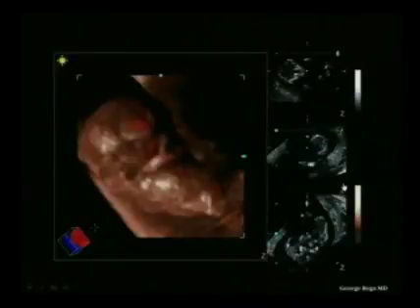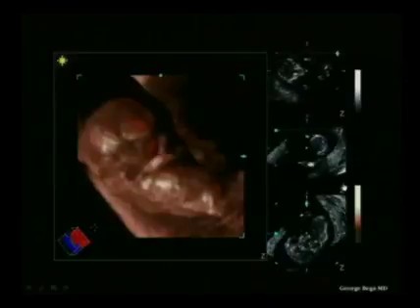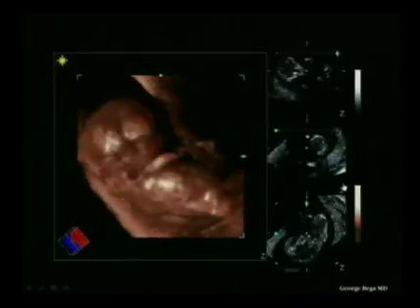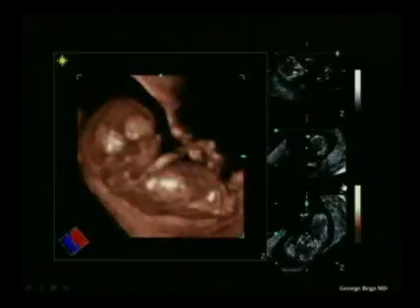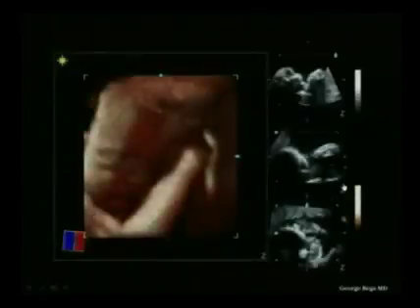Of course, you can change the light sources. This is an interface by Siemens. As you can see here, by a cursor, you can go over the area of interest and you can illuminate parts of the anatomy that you feel you have more interest on. So as you can see, the light sources now are becoming much more flexible to the user.